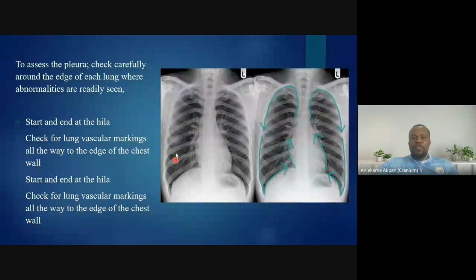And I said before, in the beginning of this class, that we can also have pus collecting there. You can have blood. You can even have a mass collecting there. Where chest X-ray is not really sufficient for diagnosis, other modalities can be advised, like ultrasound for the lungs as well. Chest CT can also be advised. MRI and biopsy are other tests that can also evaluate lung pathology.